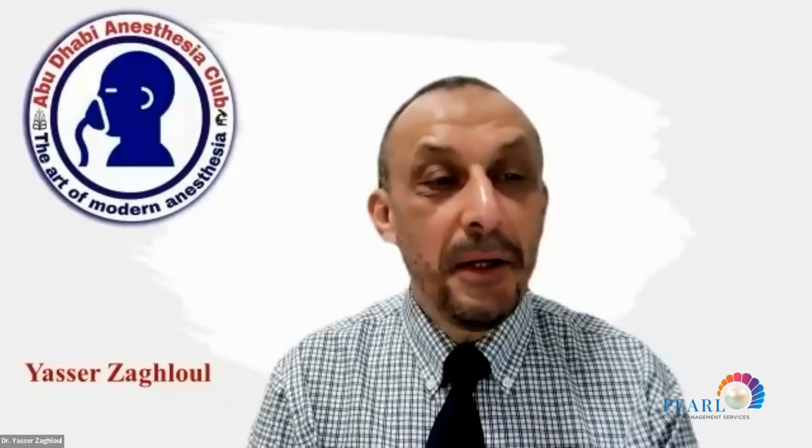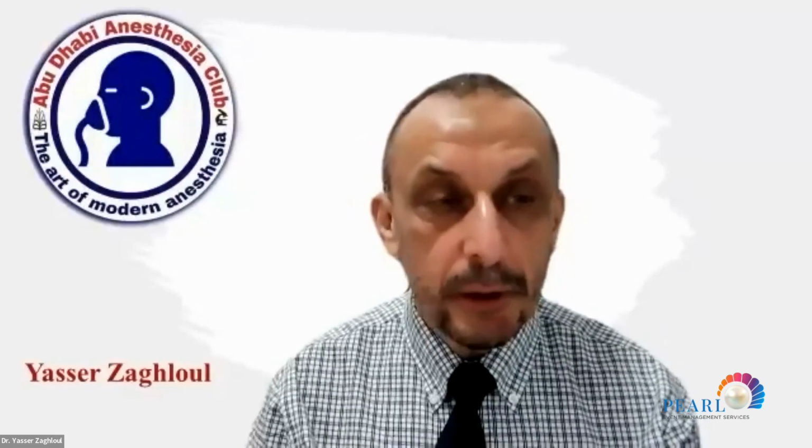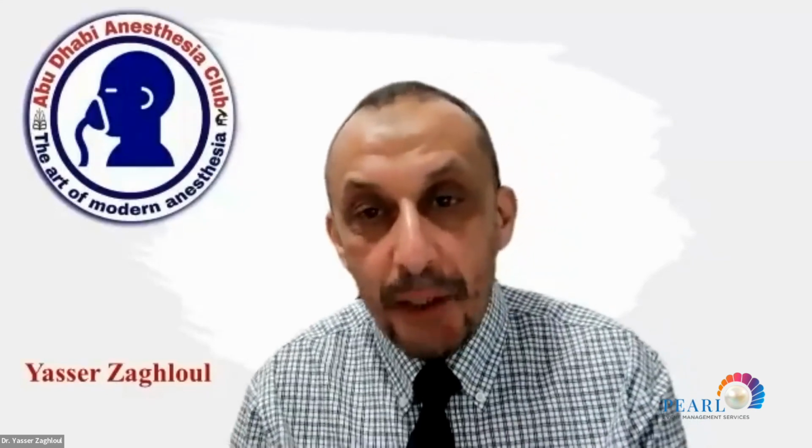All right. Maybe because of the time, I have just two questions for you. First question, when should we do the ultrasound assessment of the airway? It should be in all patients. And if we are going to do it, is it better to do it in the pre-anesthesia clinic or just pre-induction? It depends upon your time, to be honest with you.